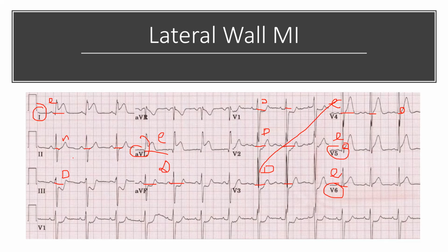Okay, so in this particular presentation that we have had, we have identified the markers of STEMI, and they are an ST elevation that should be significant. Significant means to say that there is going to be a 2 mm elevation in the V leads or 1 mm in the limb leads. Or, and I should say, that there should be in 2 contiguous leads.